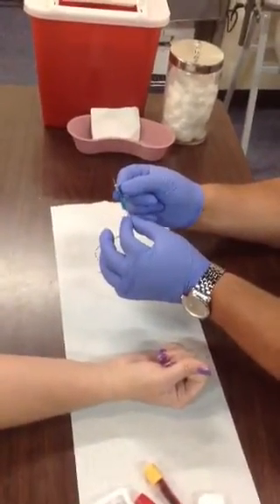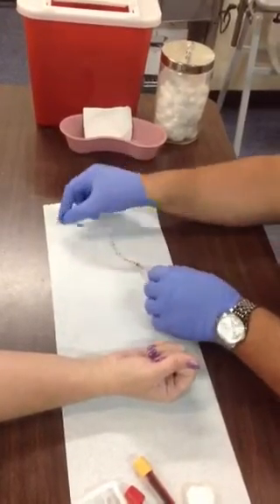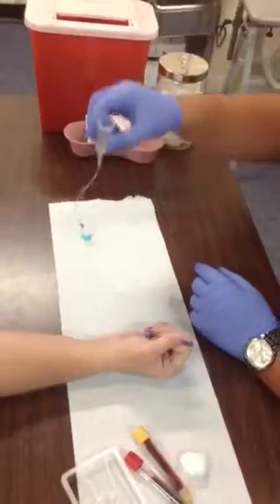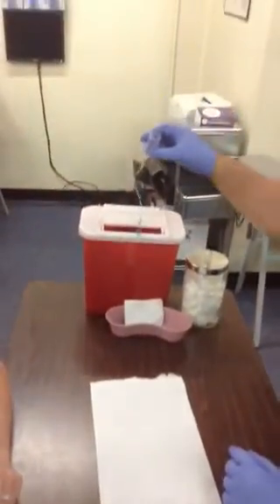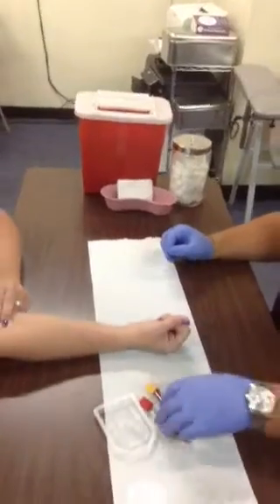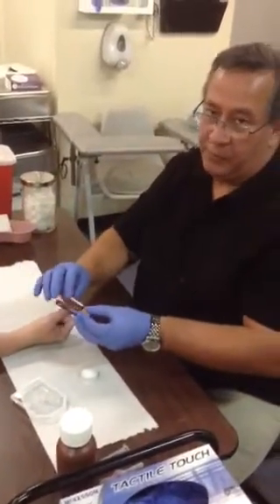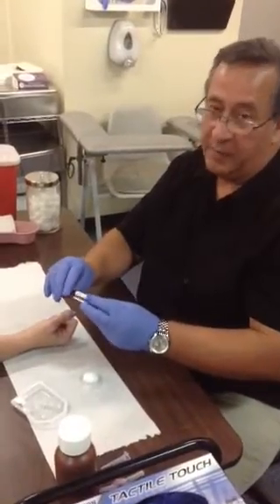Push the wings up while holding the tubing down until you hear that little click. Then set your needle down, grab the adapter, direct the needle into the sharps — drop the needle in first, and then the adapter behind it. If the tubes need to be inverted, invert them. Then label your tubes with the patient's name, the date, and the time of draw.